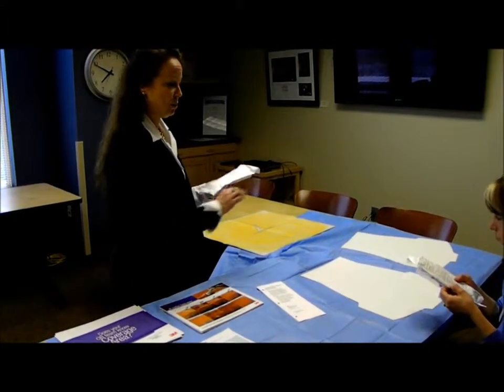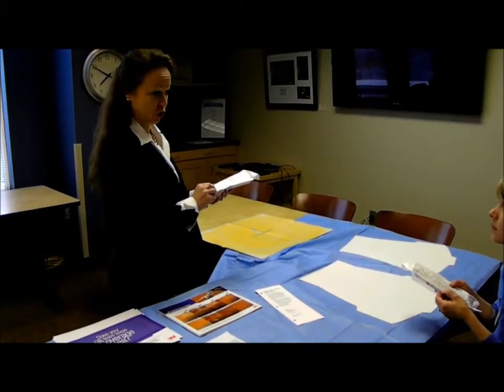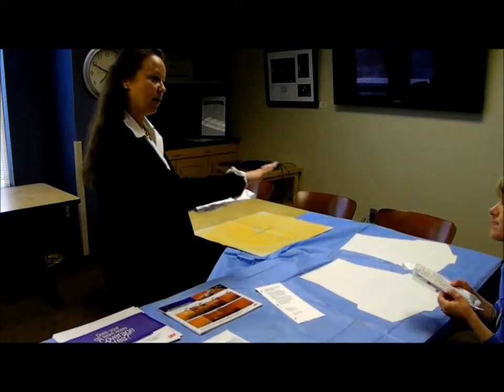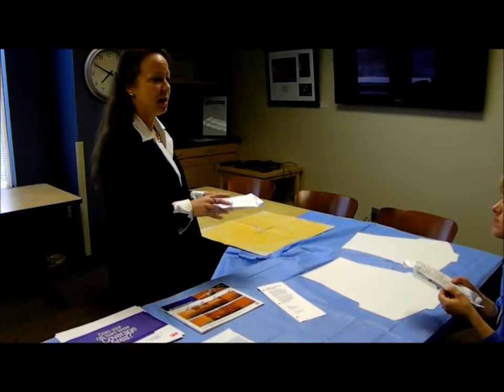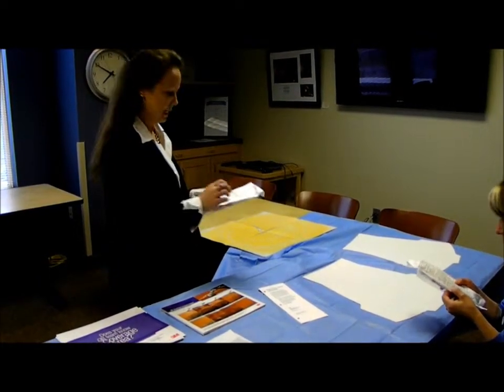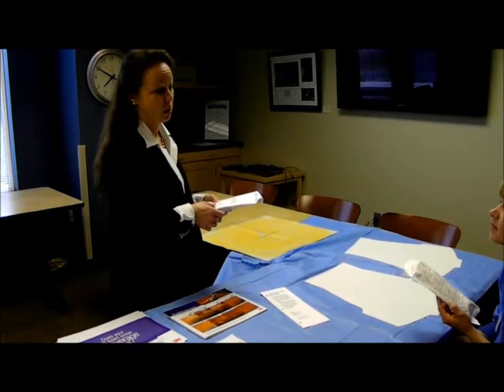All we want to do is paint on so we get a nice, even application. Okay. The iodine povacrylex in this product is what makes it stay. So it kind of creates a film. What's really nice about that, and you've probably noticed, it doesn't wash away easily. It stays there even if you have blood and a lot of irrigation. So it stays there and it fights off the microbes for at least 48 hours.